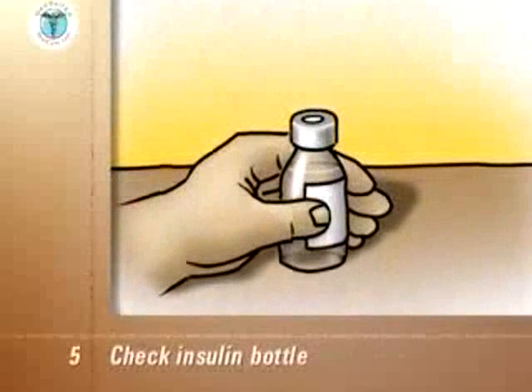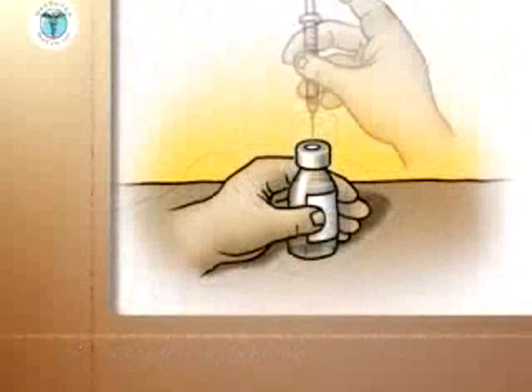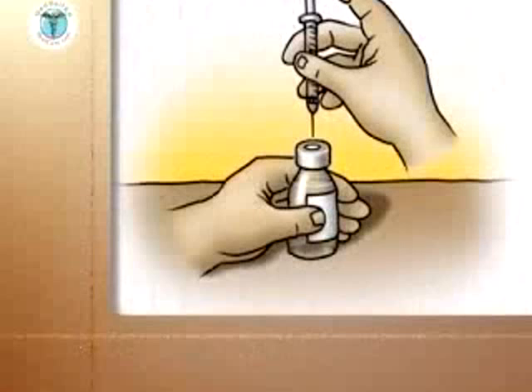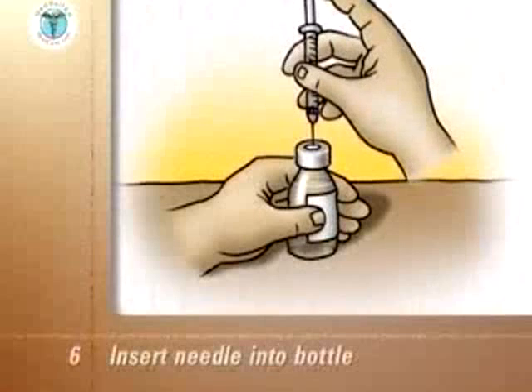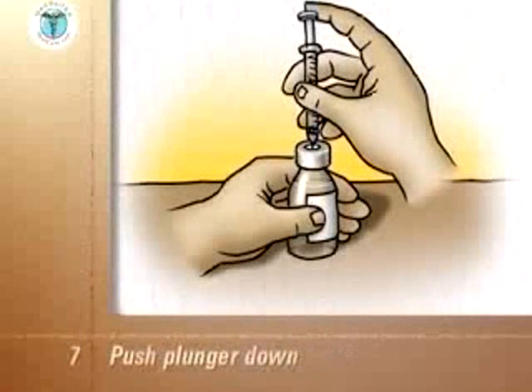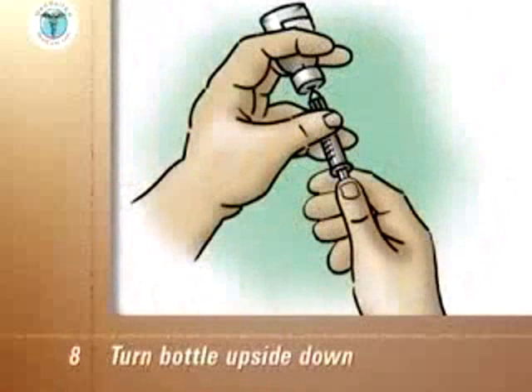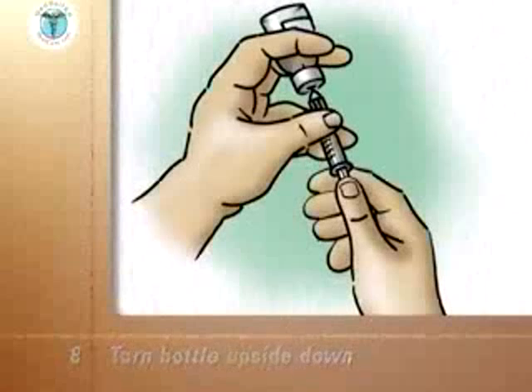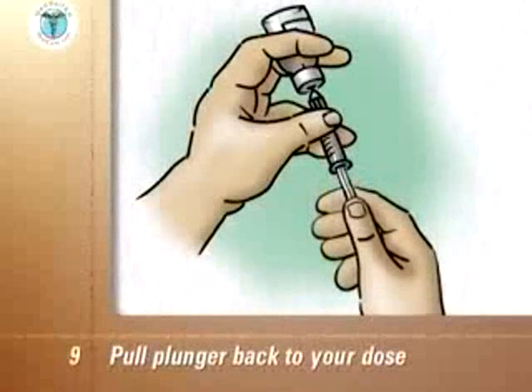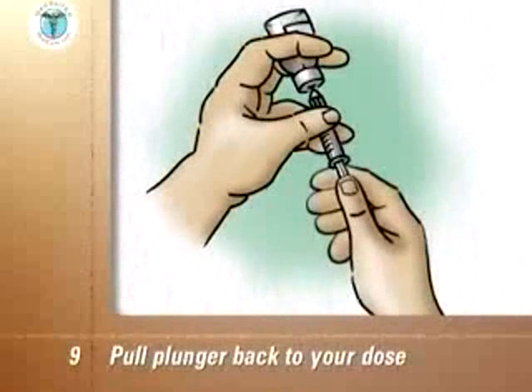Check the insulin bottle to ensure you have the correct type of insulin. With the insulin bottle held firmly on a counter or tabletop, insert the needle through the rubber cap into the bottle. Push the plunger down so that the air goes from the syringe into the bottle. Turn the bottle upside down so that the air in it is at the top. With the tip of the needle kept in the liquid, pull the plunger back to your dose. If any air bubbles are in the syringe, push the plunger back in and draw off the dose again.